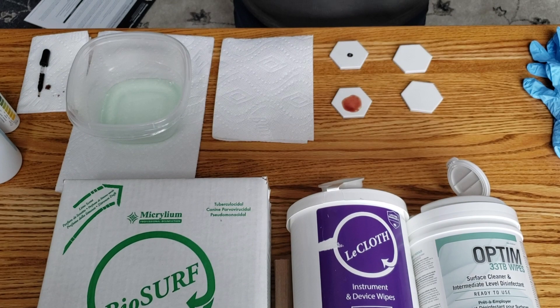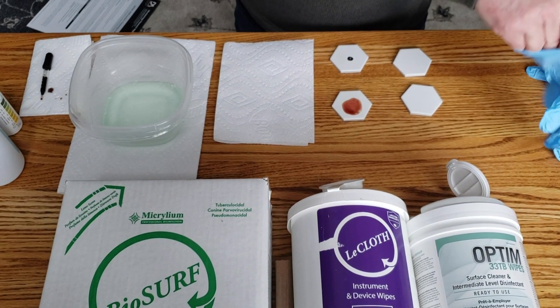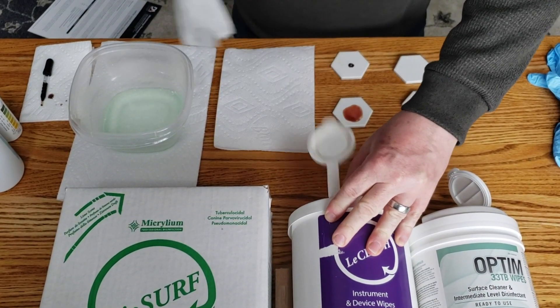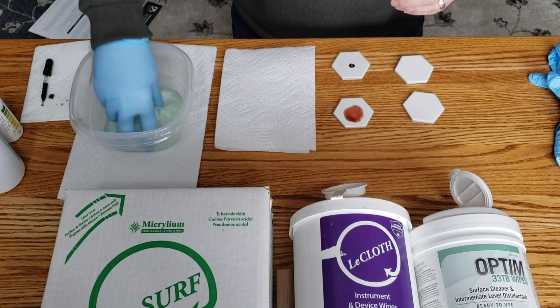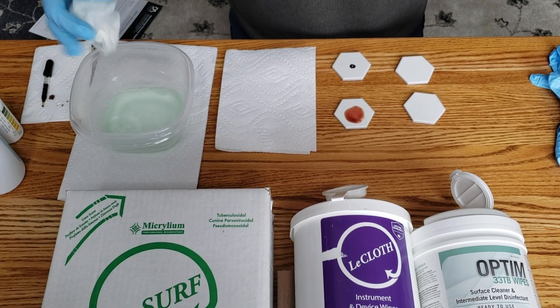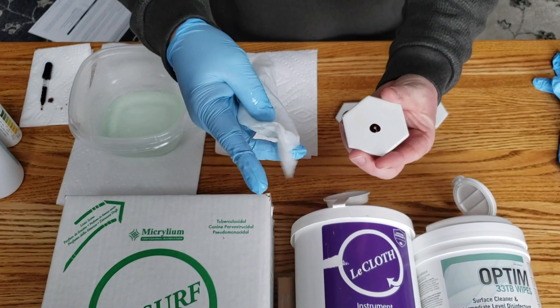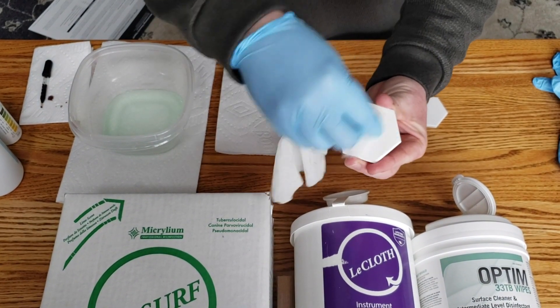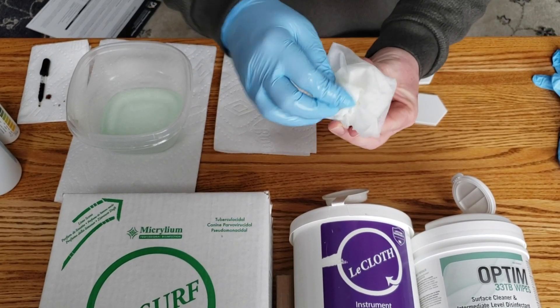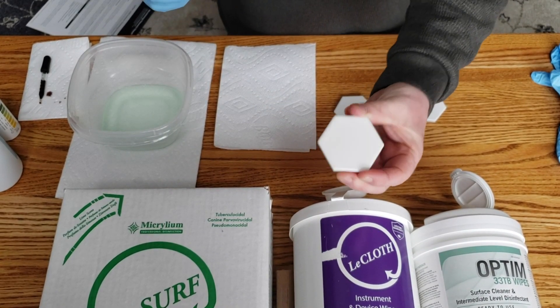I'll change my glove and now we'll try the BioSurf. We'll take one of their LeCloth wipes, saturate it in BioSurf, wring out the excess, then take the wipe and clean the wet blood — wiping for a five-second count. No visible blood.